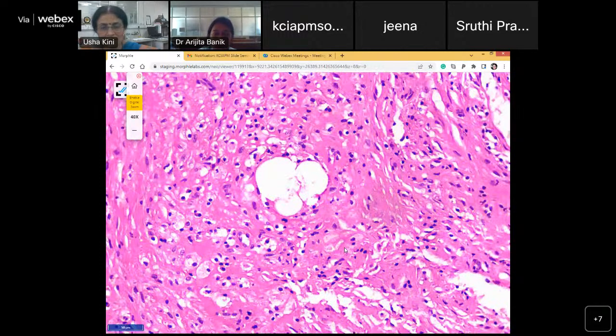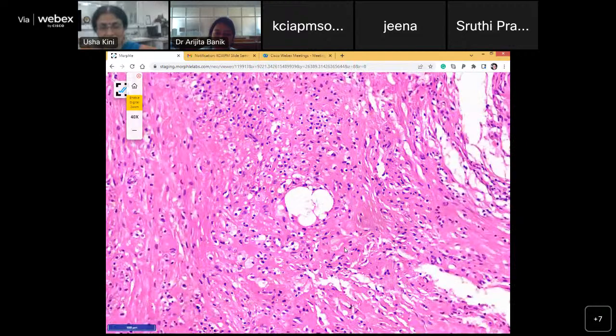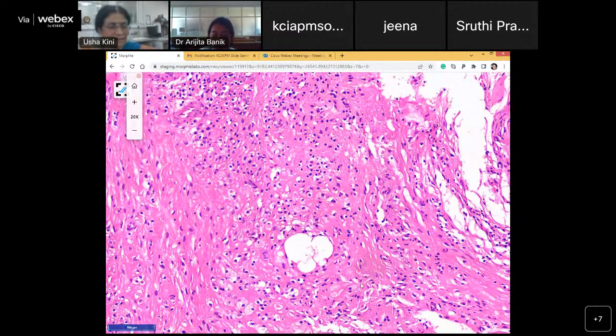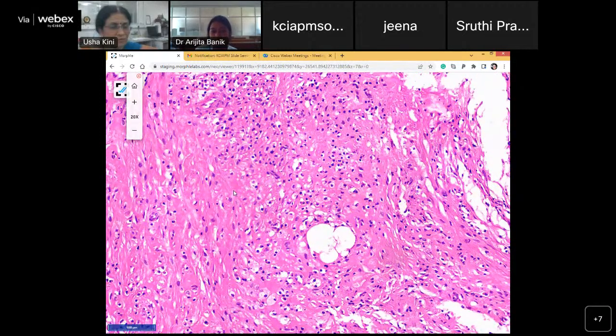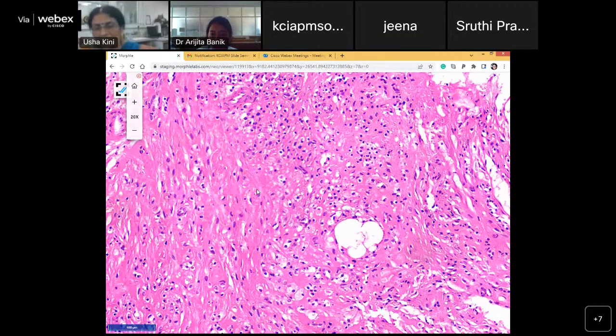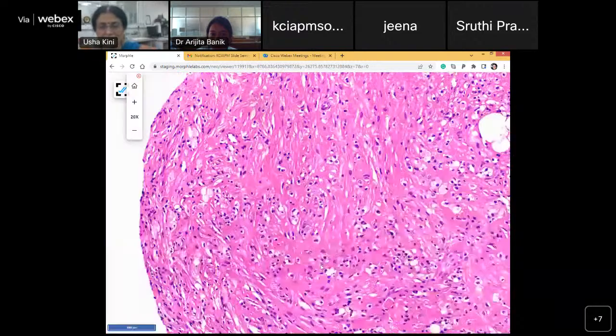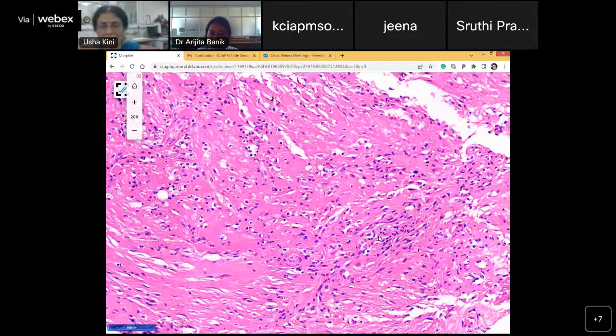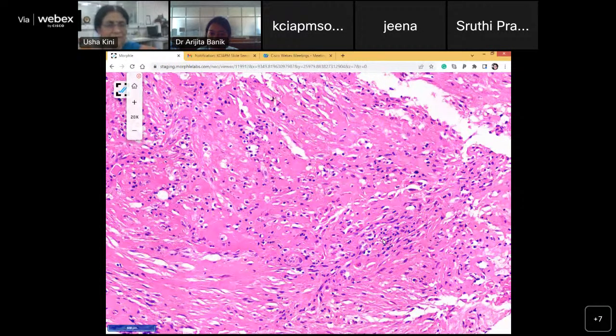And what about this? What can that be in the middle of this? Marrow element. Yes, that is the fat, right? The marrow fat element has got trapped in this. If you see, there are lots of these foamy histiocytes as you described. And here is a fragmented bone, which probably is dead, right? Yes, ma'am. So you have viable and dead bone, and you have this kind of cells.